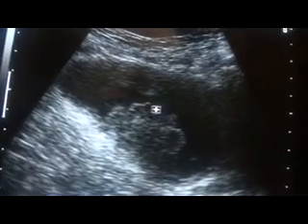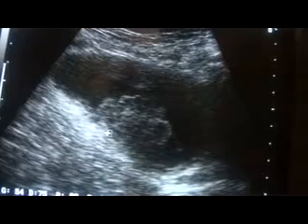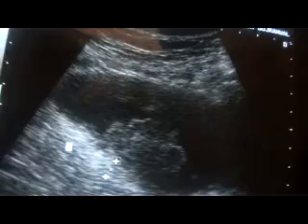Let's now see the kidneys of the patient to see from where the blood is coming. This helps us in our diagnosis of clot in the urinary bladder and not a transitional cell carcinoma.